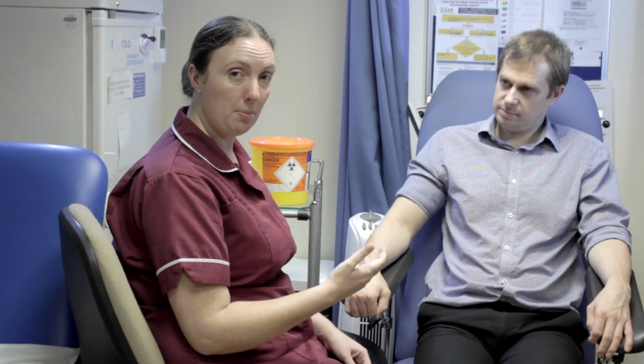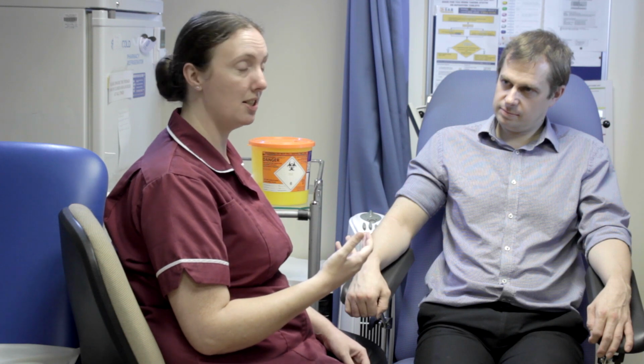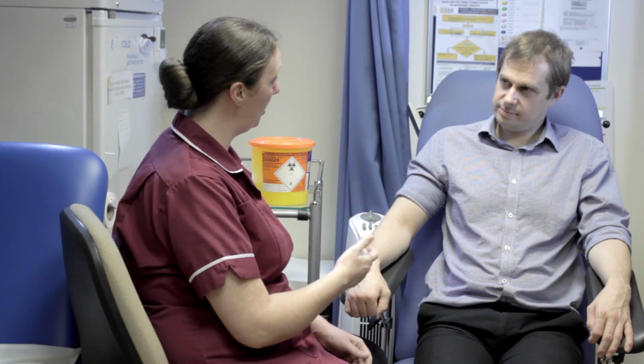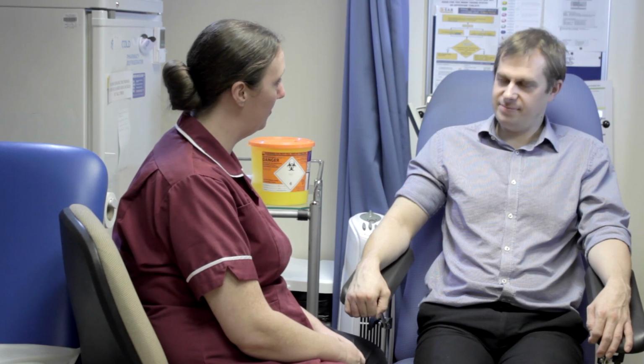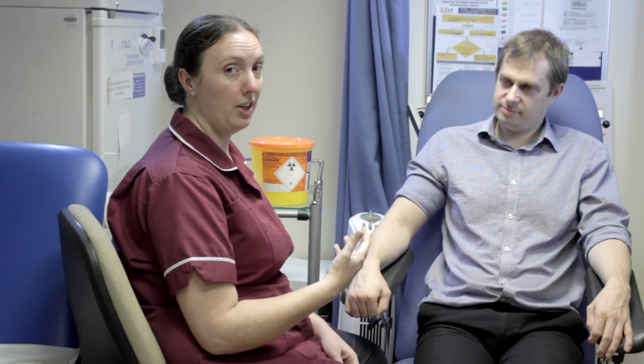Next, I'm going to greet my patient, explain who I am, why I'm there, and get their consent. So, good morning, my name is Sarah. I'm here to take some blood from you today. Is that okay with you? Yes, that's fine.